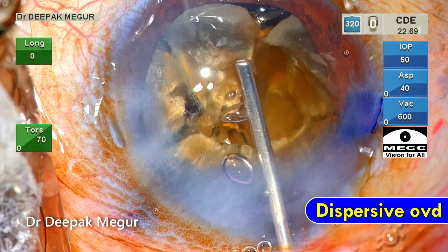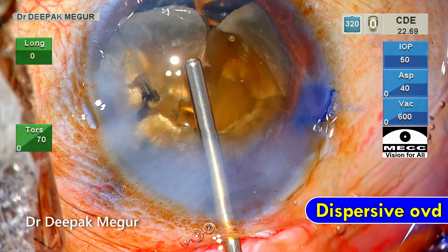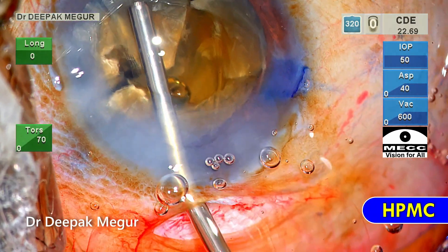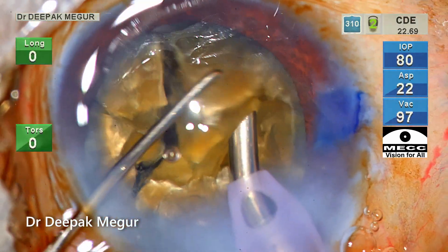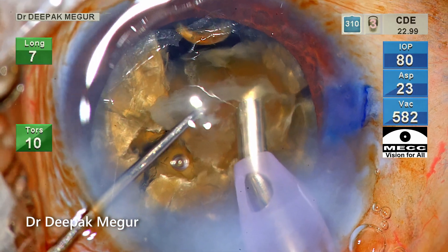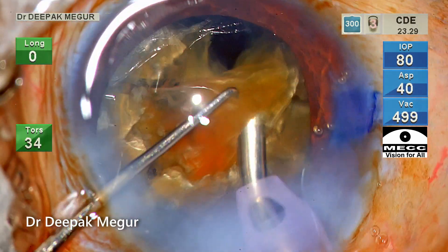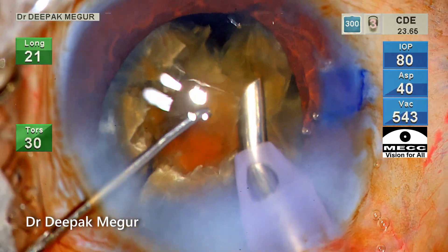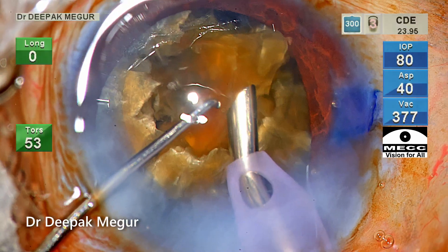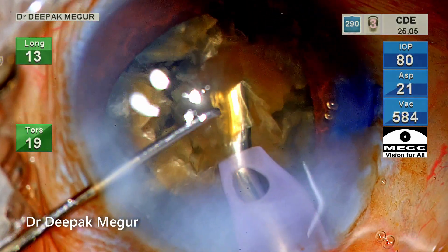Time to deal with the quadrants. As I mentioned, the eye is very small — the horizontal white-to-white diameter is very small — and there is a lot of crowding in the anterior segment. So I don't want emulsification happening very near the anterior chamber. I'm ensuring that emulsification is being done at the level of the iris. Please note the position of the bevel — it is facing slightly downwards and towards my left — and my chopper in the left hand is ensuring that none of the fragments are jutting out and flying away.